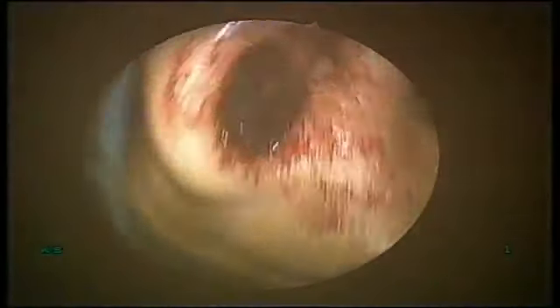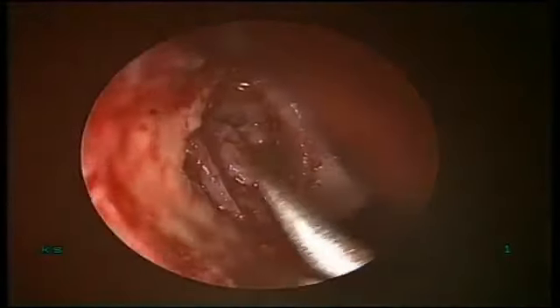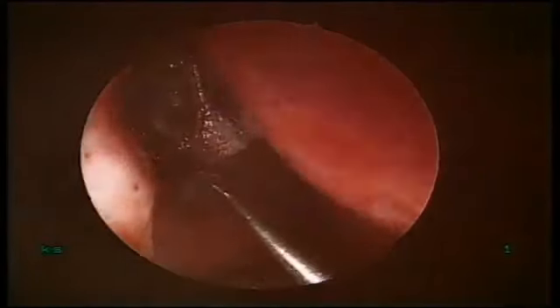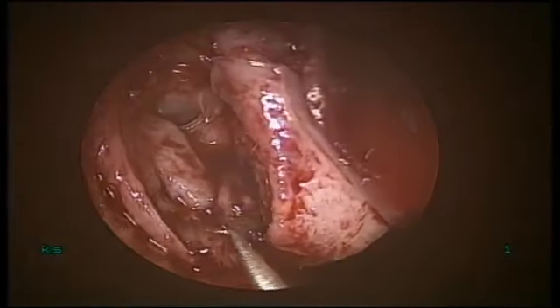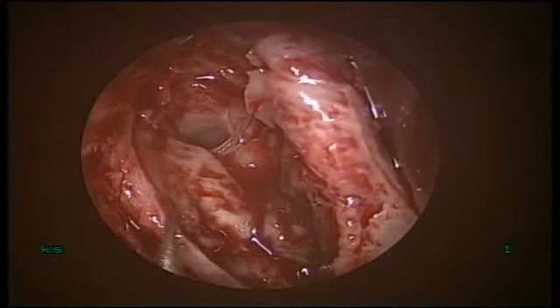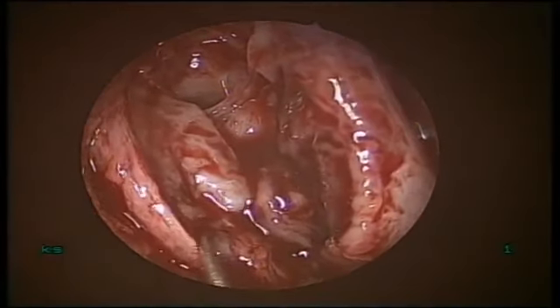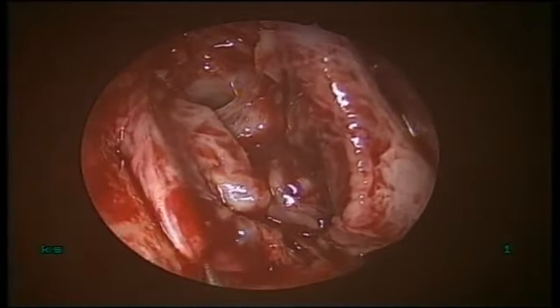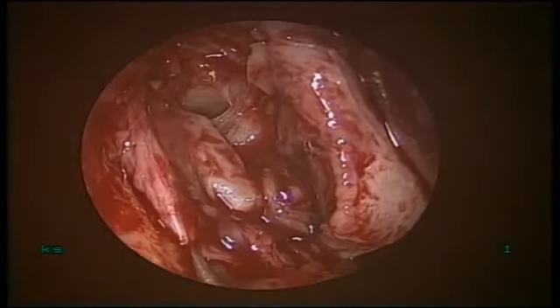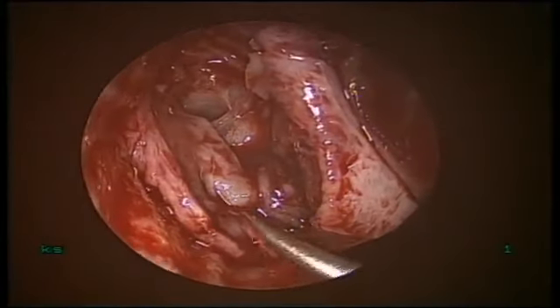Now what to do with the interior flap? See that? For the interior flap, see this is the posterior flap. Yes, sir. This is the lumen. Yes, sir. Now this is the posterior flap, anterior flap. See, I am using the sharp right angle. Yes, sir. This is not very sharp here.